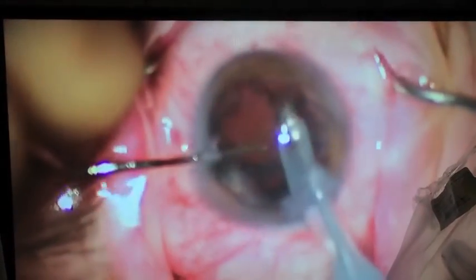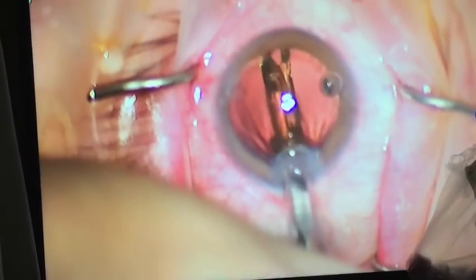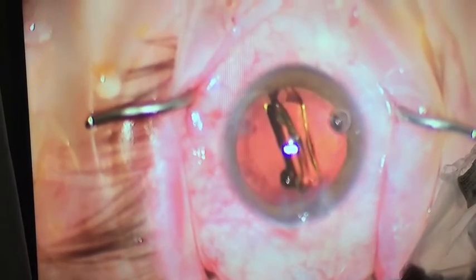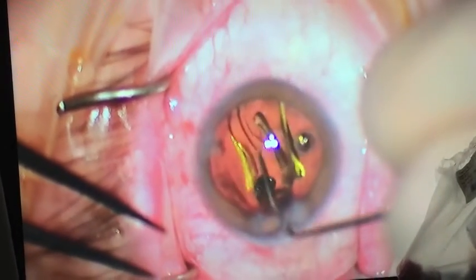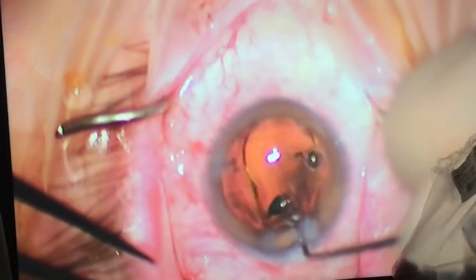Now we're removing the cataract from the old bag of the lens, and we'll be left with the bag so that we can place a brand new lens. After the cataract is removed, I am inserting a lens designed to reduce the patient's dependence on glasses. This lens is specifically calculated for each individual patient and will allow the best possible vision after surgery. You can see the lens being placed in the old bag.